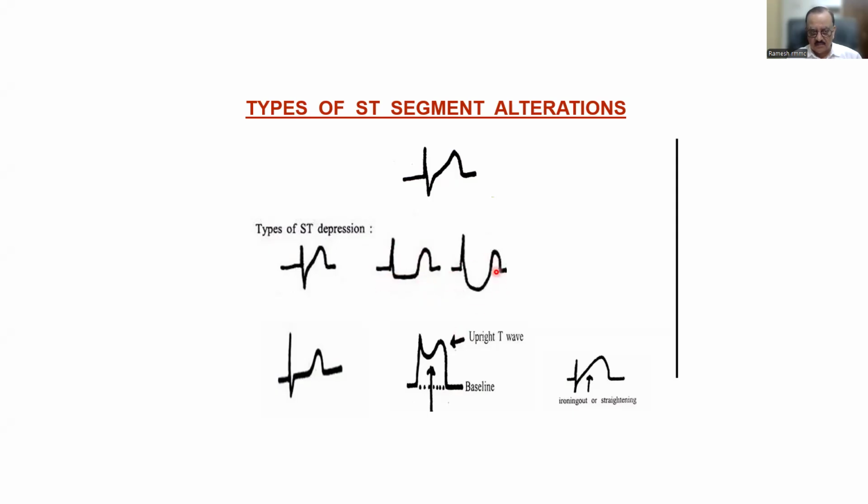See this ST. Is it a normal ST segment? Compare this ST. It is a significant ST depression. A significant ST depression. This is an acute event. This patient has to be admitted.